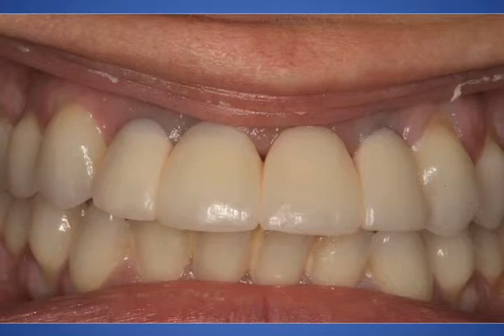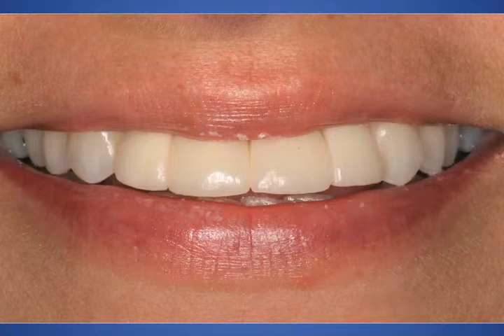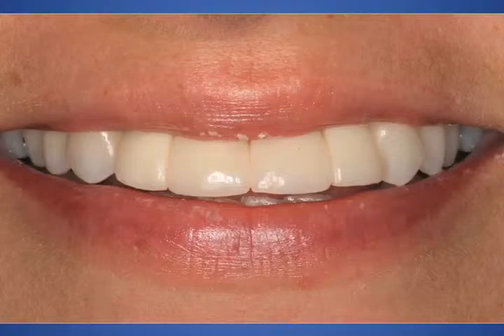Still not ideal. You can see the little purplish of the gingiva and the lateral incisor areas, but that area has been traumatized quite a bit over a number of years, and then traumatized again when we extracted the teeth and placed the implants. So I'm not overly concerned with that. We're just trying to create some interdental papilla for this woman. And again, a smile line immediately on cementation or placement of the crowns, temporary crowns.